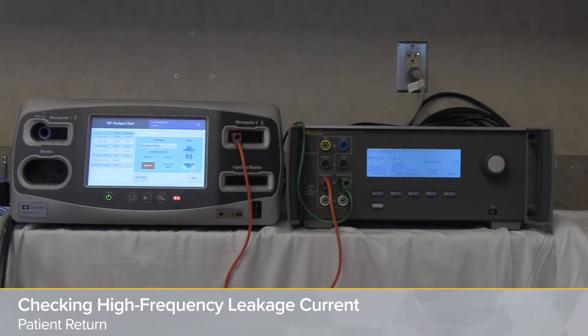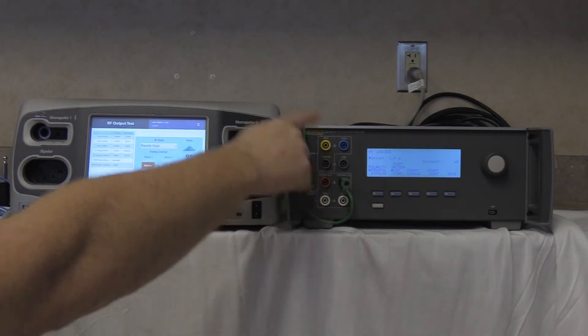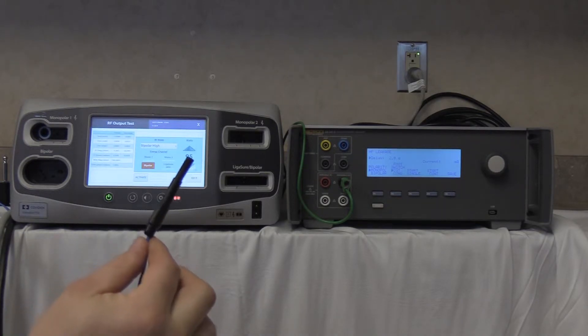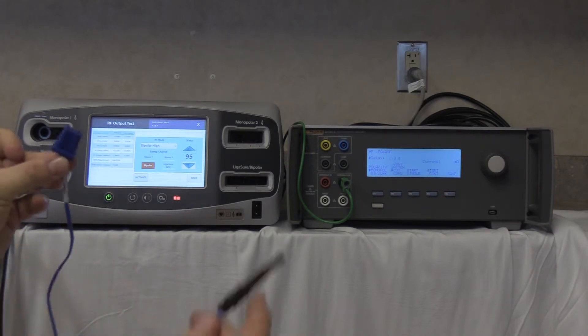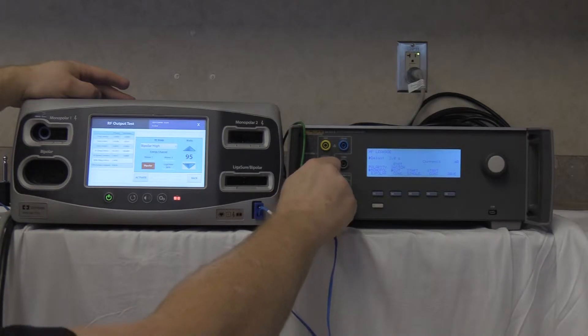Checking the patient return high frequency leakage current. Remove the setup from the monopolar but leave the green wire connected from the variable low to the ground lug on the back of the unit. Take the shorted REM cable — the ESU dispersive safety lead as specified by the FT10 manual and QAES-3 — shorted together, and connect it into the REM port and into the variable high of the QAES-3.